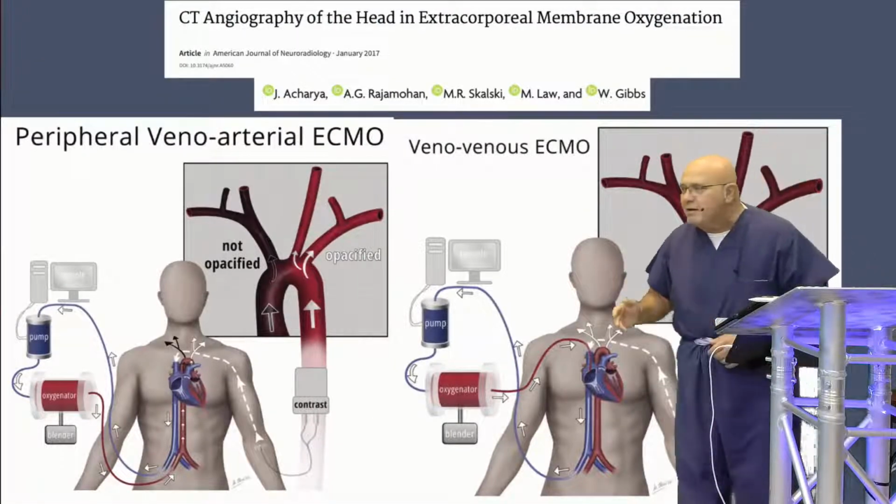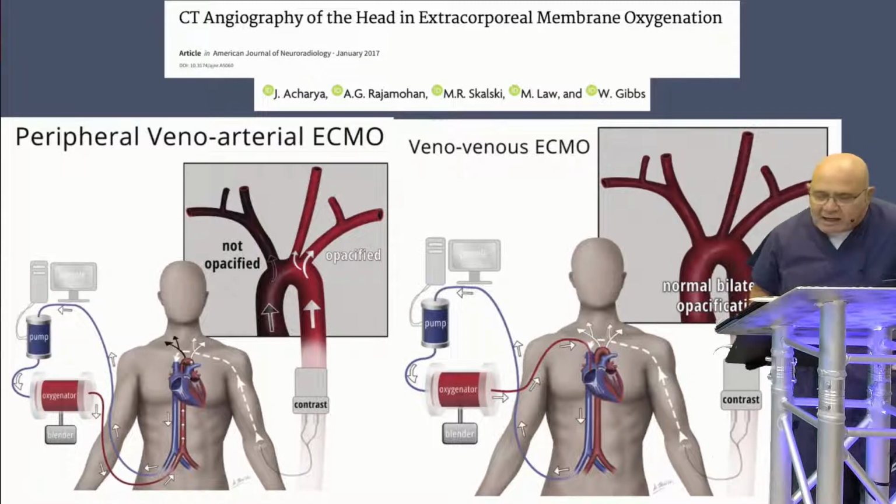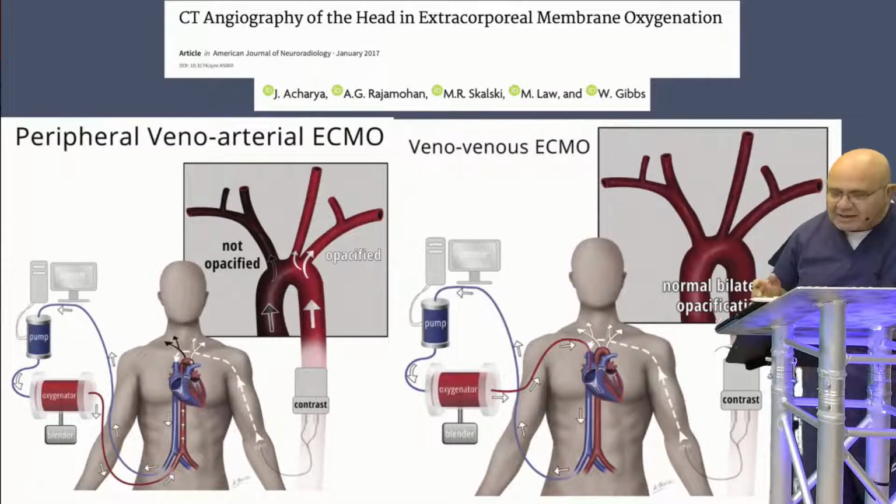This was a very interesting study, and I want to move out of the way so that you can see it, by Acharya and colleagues. I just thought it was very interesting. It's a CT angiography of the head and extracorporeal membrane oxygenation.